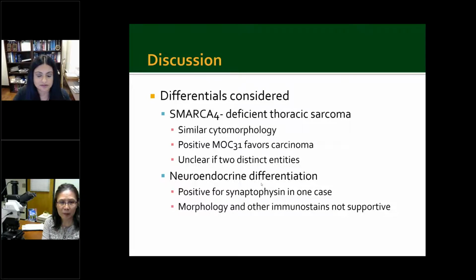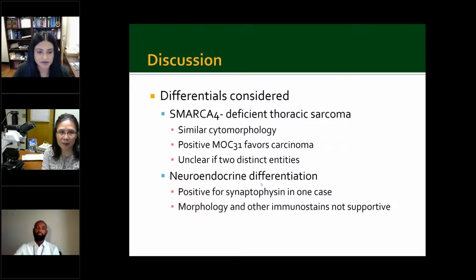So this was something I talked about in the Twitter chat last night. If any of the participants from that are here today, one of the questions I asked is, what do you do in routine clinical cases where the morphology is non-small cell? It's negative for TTF or napsin, it's negative for P40 and P63. What's your next step? It depends on the morphology, and it also depends on how much tissue you have. For me, my next step is always to do a pan-keratin, if I haven't done it up front, just to confirm that I am dealing with a carcinoma.